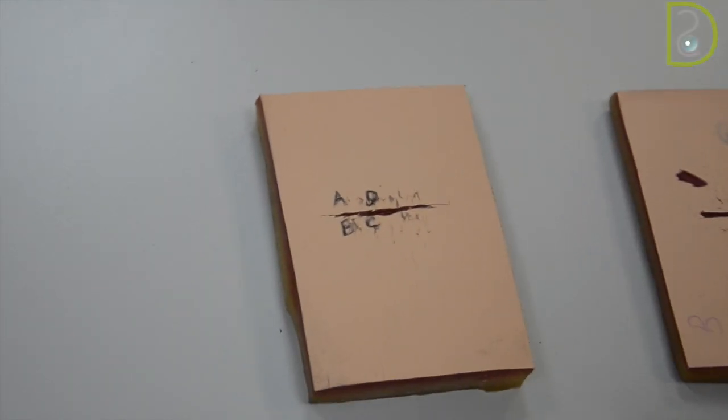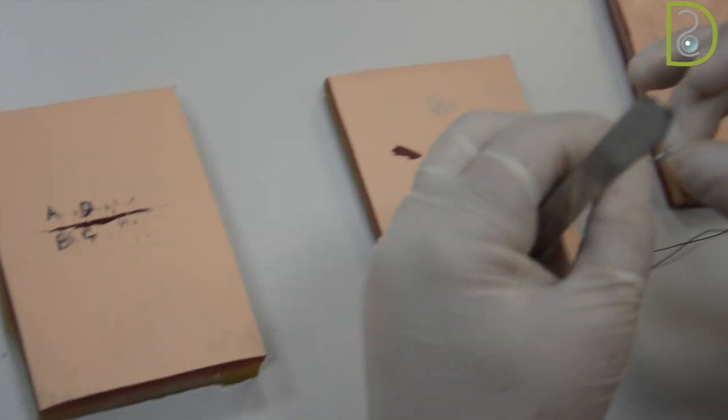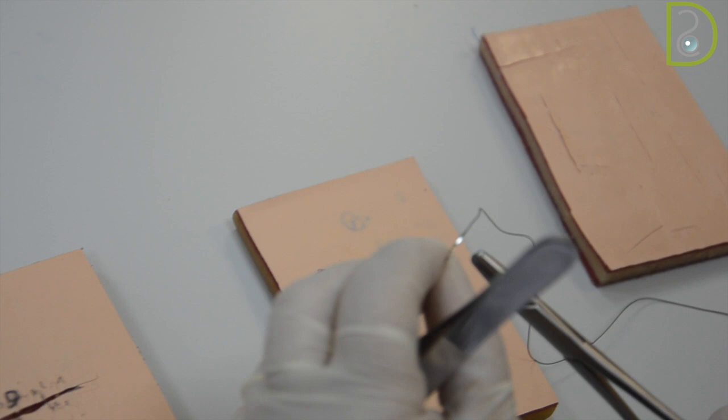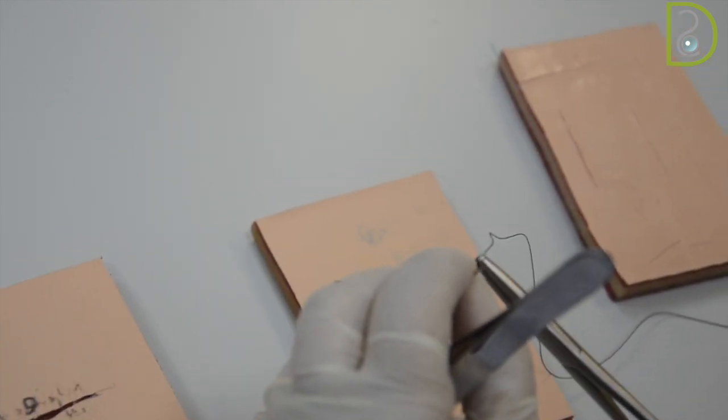I will demonstrate how to do a figure of eight suture. When using the needle holder, we have to look at the needle itself and stay away from the sleeve a little bit, grasping the needle from its last third.